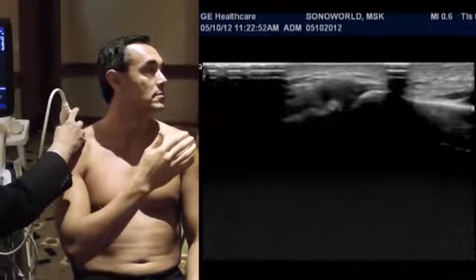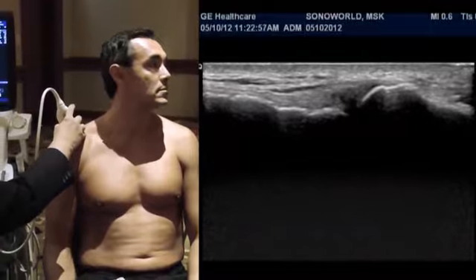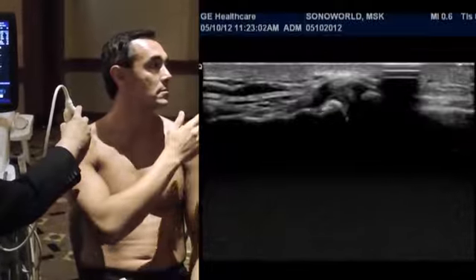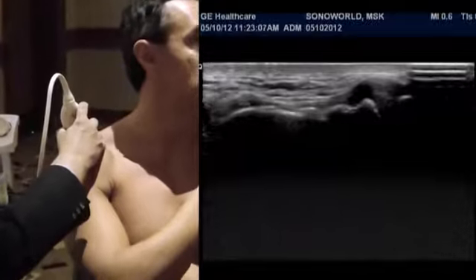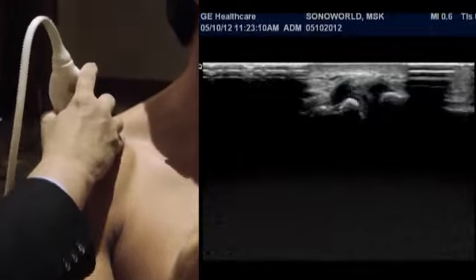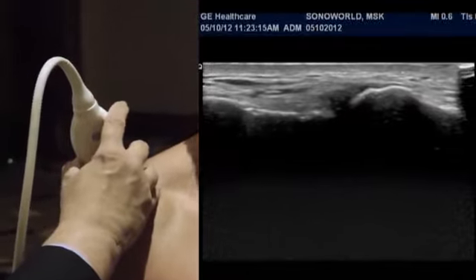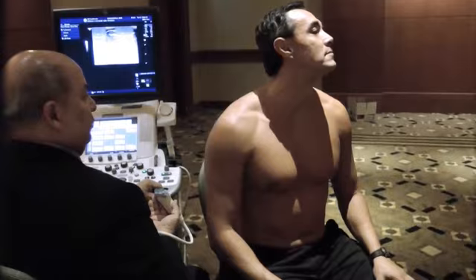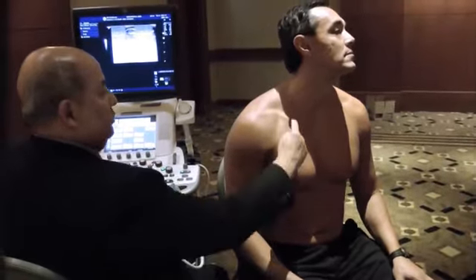The abnormality often found in this region is going to be the superior subluxation of the distal clavicle as the model continues to cycle superiorly in relation to the bone acoustic landmark of the acromion. And so what you want to see in this area is a sudden upward jump of the clavicle in relation to the acromion.